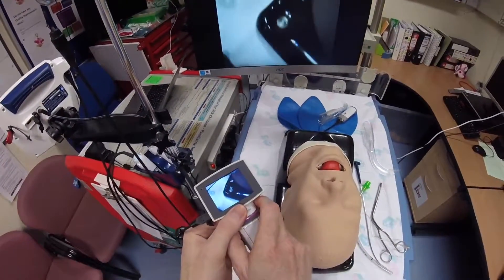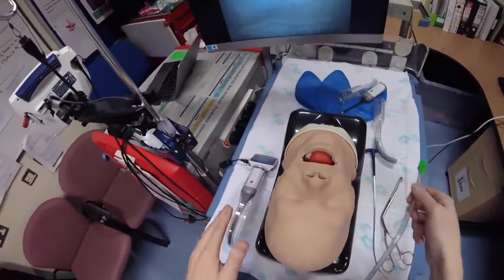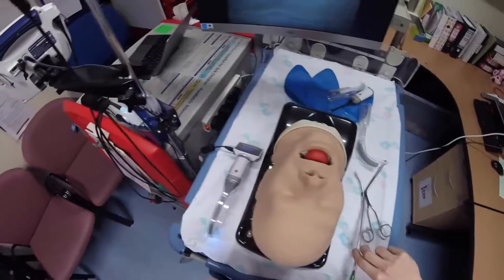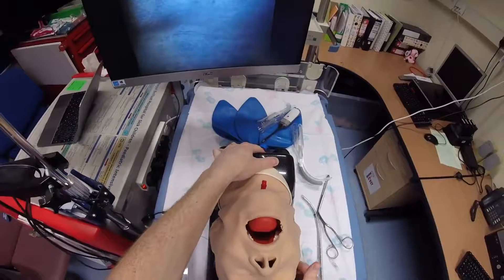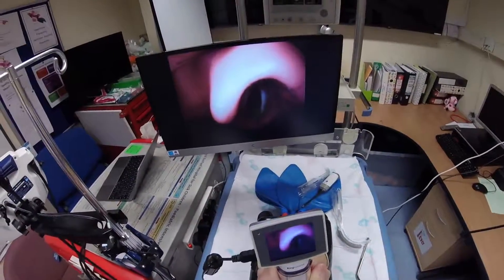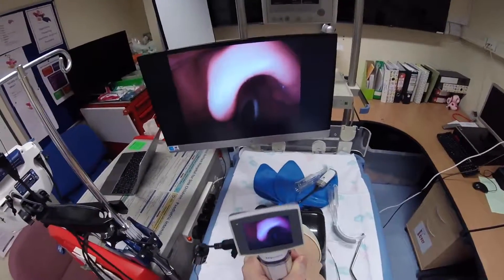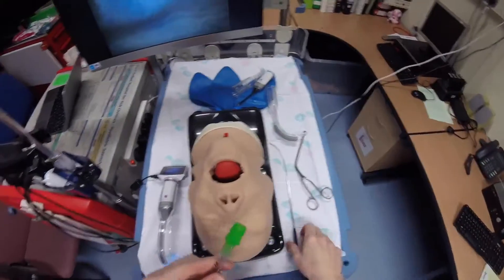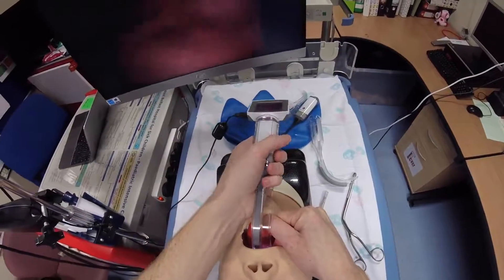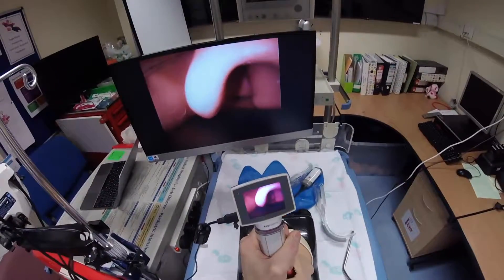Now changing over to try the un-channeled blade. Because this is a hyper-angulated video laryngoscope, a hyper-angulated stylet is required. With the stylet tube ready, first trying in the easier setting — no difficulty with that. Running it again in the slightly more difficult setting with the head flexed — similar view to the channeled blade.